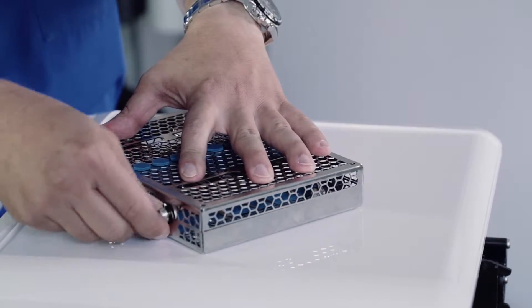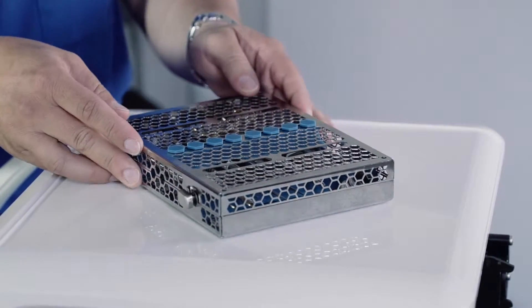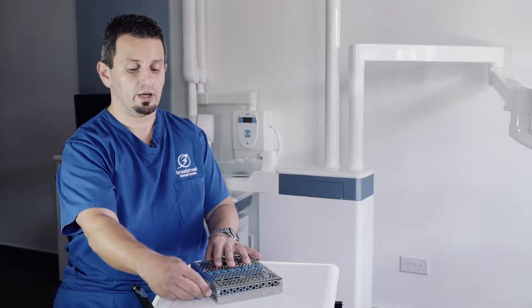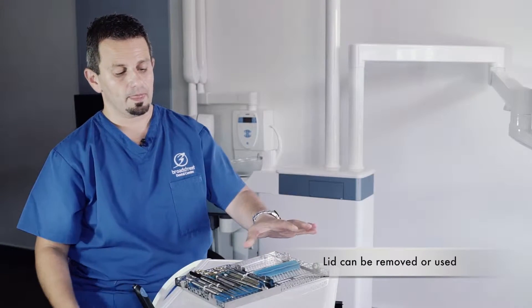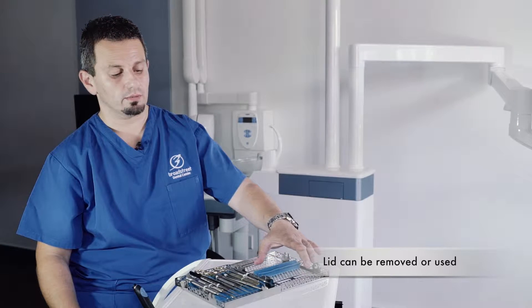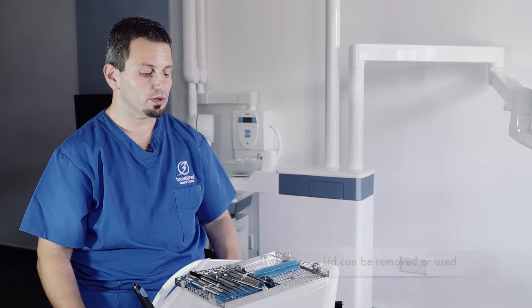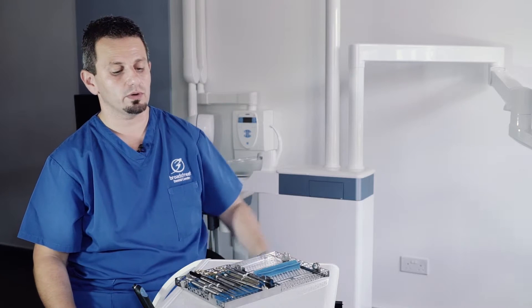And when you use it next to a patient, do you actually remove the entire lid or do you use the lid as well? No. Sometimes, because the lid is sterile — obviously everything is sterile — this part of the cassette can be used to put tools or whatever you're using which you need to remain sterile, right over here, so that you don't contaminate your area.